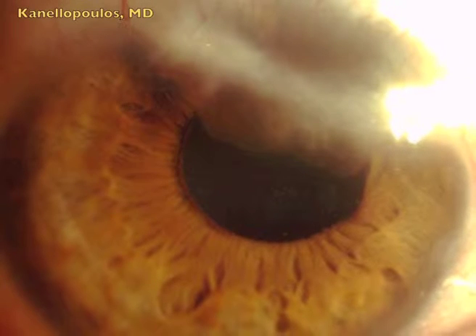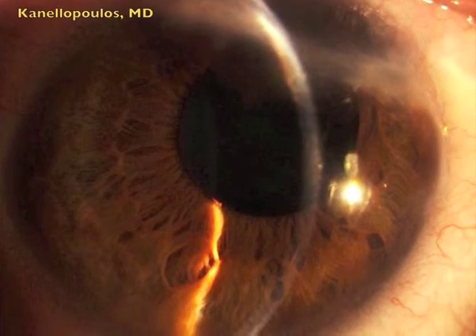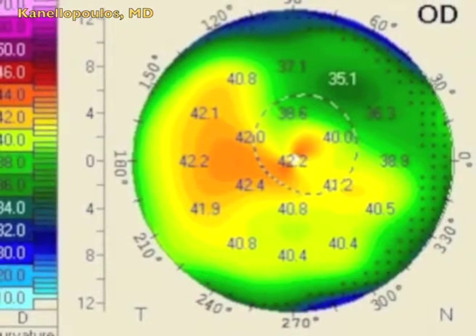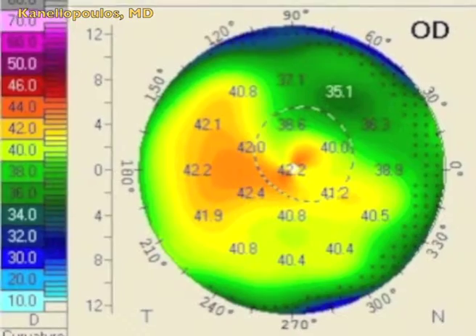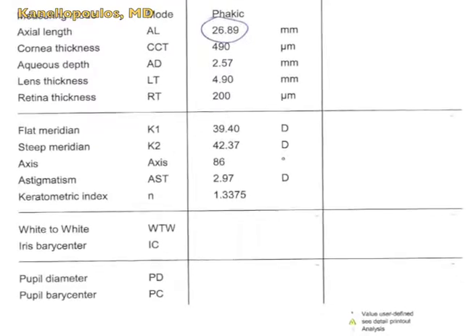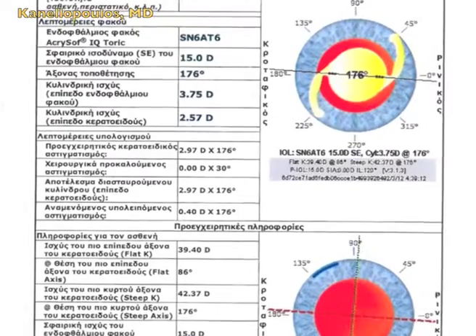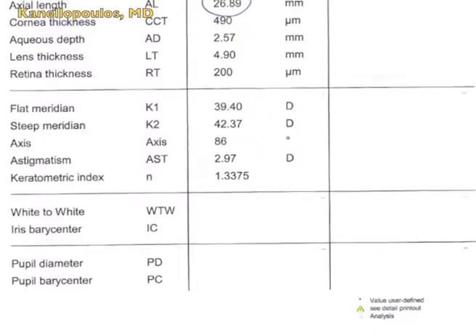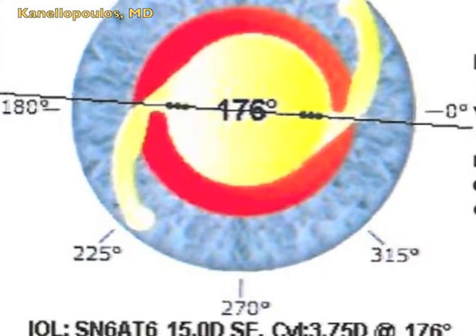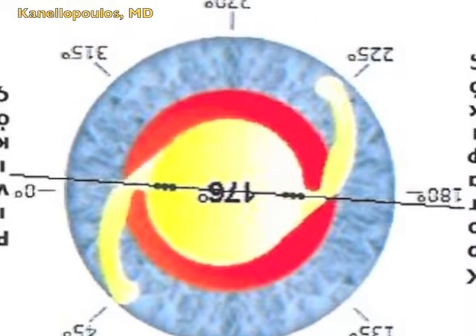Here is the significant trauma, as you can see here. It's an oblique superior cornea scar causing significant astigmatism and some ectropion of the pupil. Irregular astigmatism on the topography, more detailed here, shows how that flattening effect of the perforating injury is occurring, with normal cell counts. And here the WaveLight biograph interferometry, the toric IOL calculator, and again the interferometry numbers and how the final calculator gives us axis and power of the lens. And this is a surgical view, what we use in the OR.